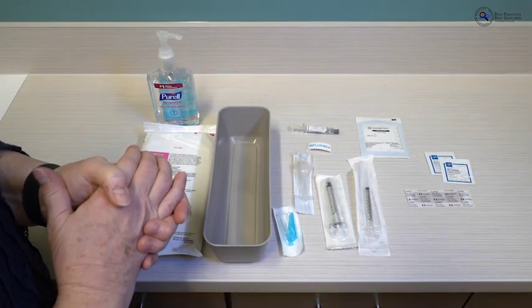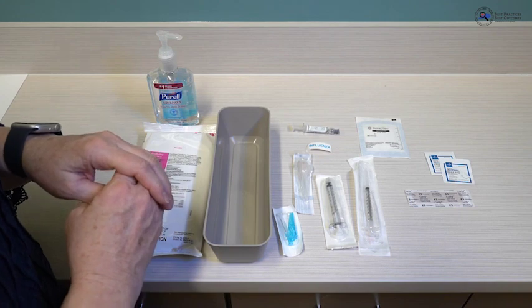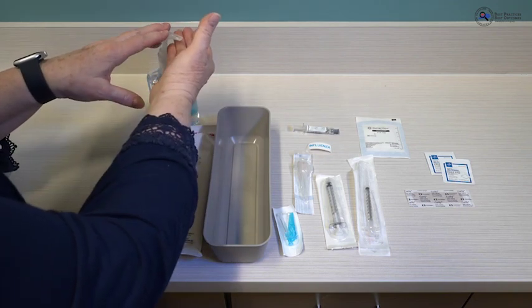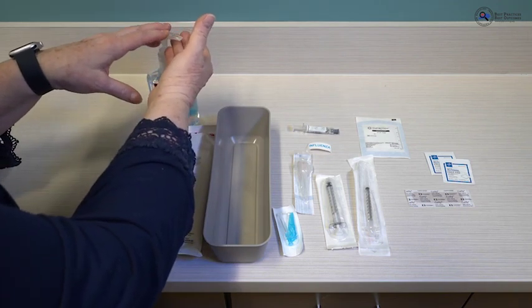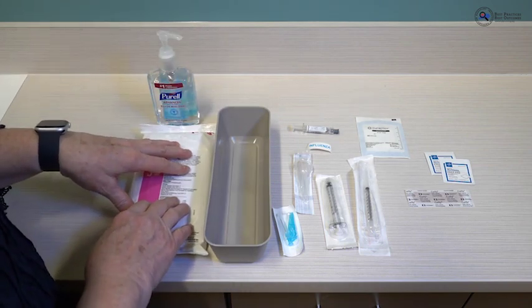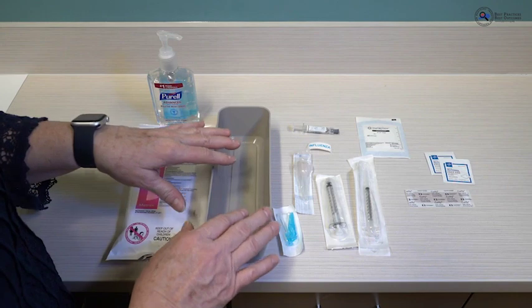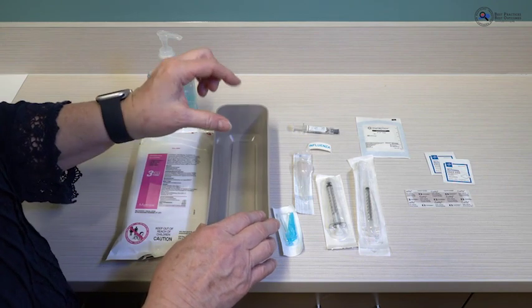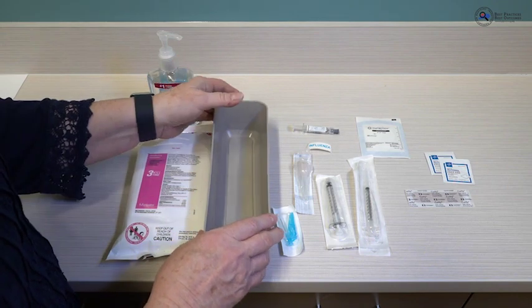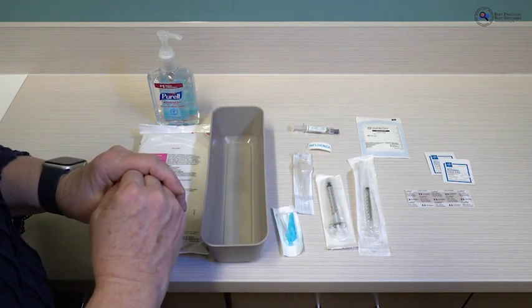Any time you are preparing medication or a vaccine, start with the basics. Always make sure your hands are cleaned — you can use an alcohol-based hand rub or soap and water. Make sure you have cleaned and disinfected your environment using an EPA-registered, hospital-grade disinfectant. Also make sure you have a container to place your prepared vaccine in for transport; it's much better than letting it sit on a countertop.